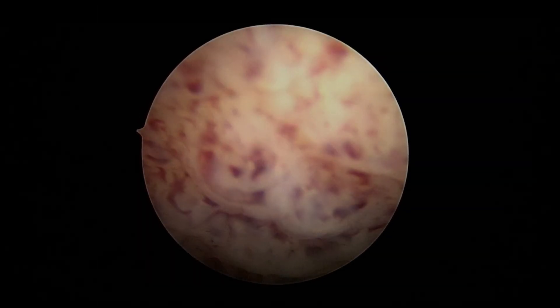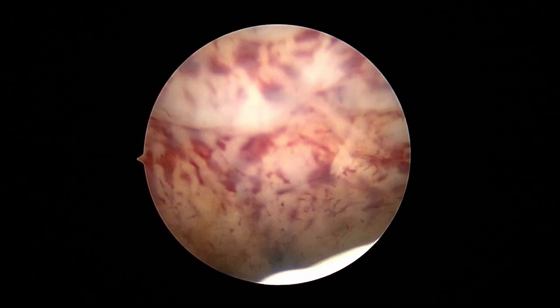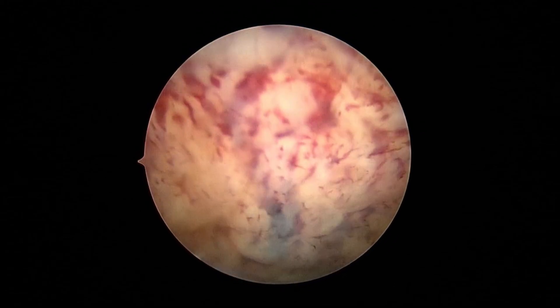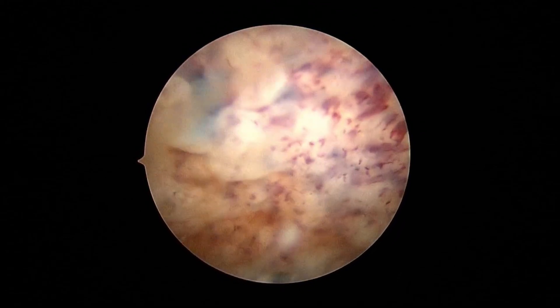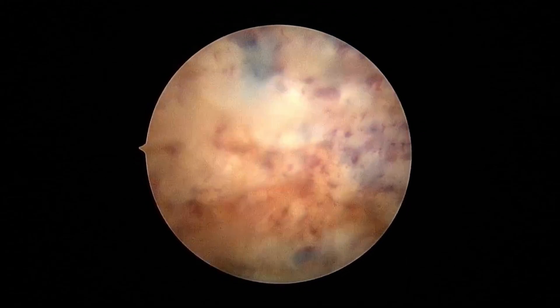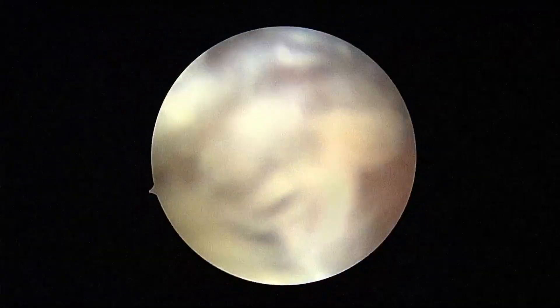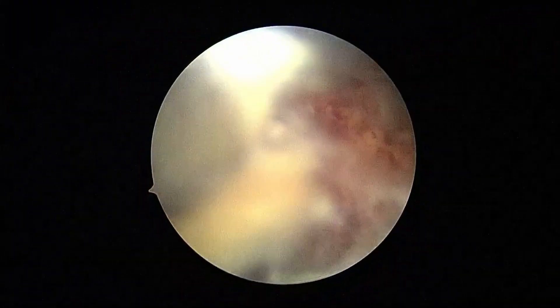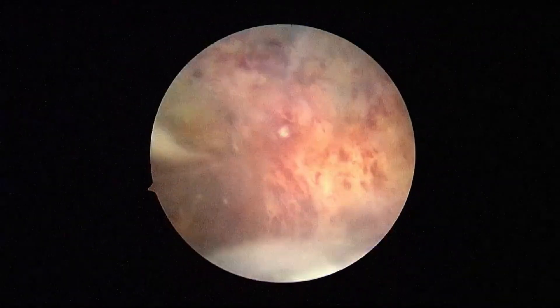Hysteroscopy was started using a no-touch technique and a vaginoscopic approach. The endometrial lining with decidualization is visible, along with marginally increased vascularity. This is basically decidua parietalis.